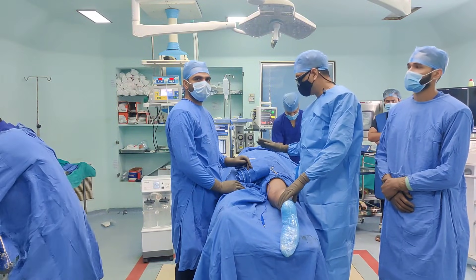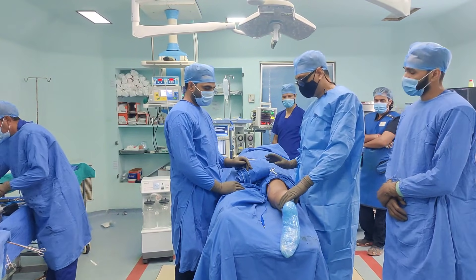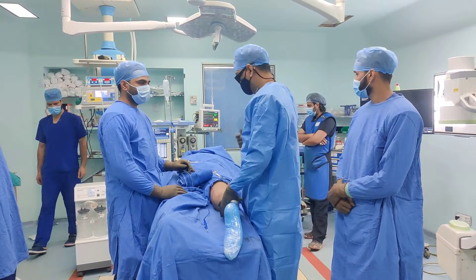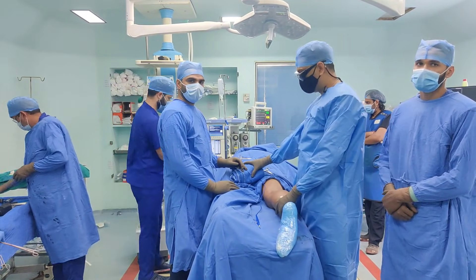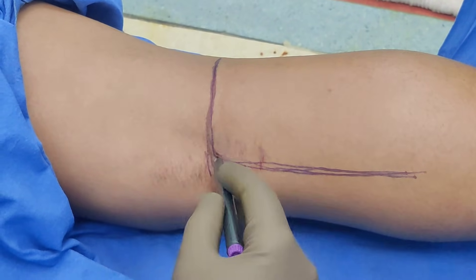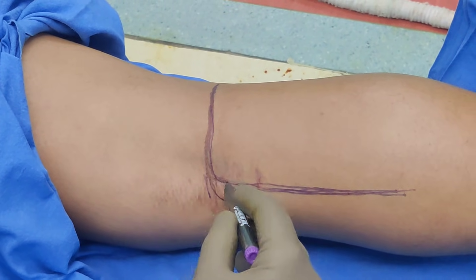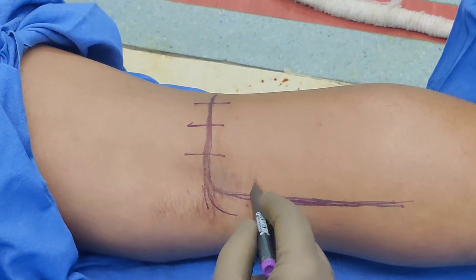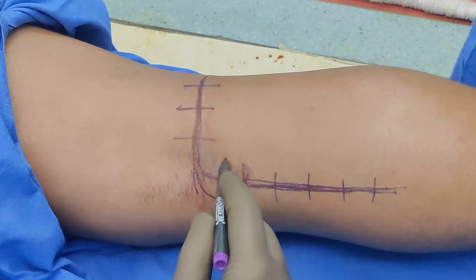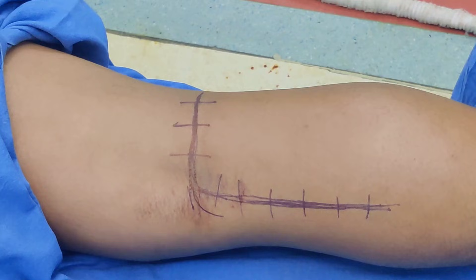Our patient is prone because most of the fracture fragments are behind. We are going to use the posteromedial approach in a prone position. We have inflated the tourniquet. My major working will be on that side — my trolley is there, my C-arm is on this side and my C-arm screen is on this side. We will use a bolster from time to time to reduce the fracture. Now the patient is prone so it can be slightly disorienting — this is the medial side, that is the lateral side, this is the head side and this is the foot side. This is where the popliteal crease is. Our incision is an L-shaped incision.